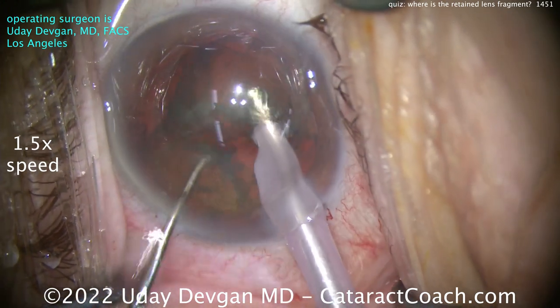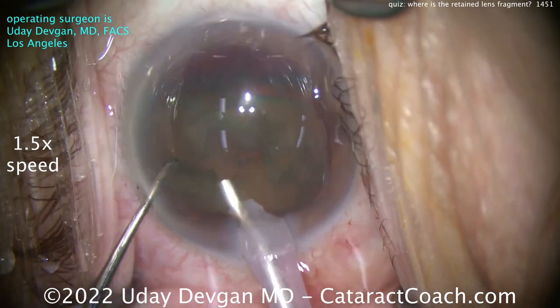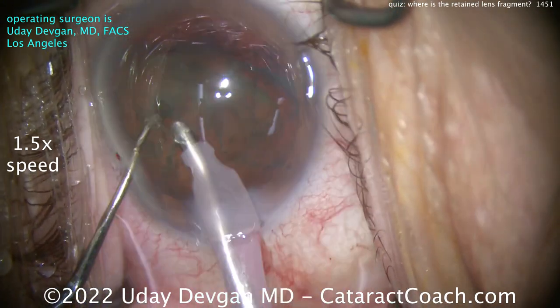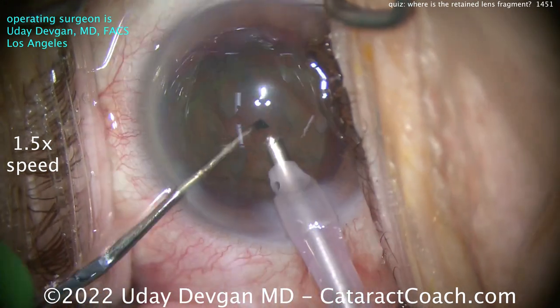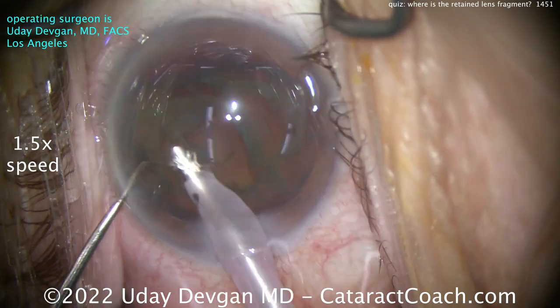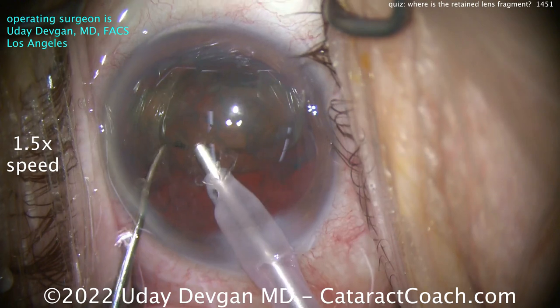Watch carefully and see where that fragment goes. That little fragment you saw in the title slide — we're going to end up with a little lens fragment coming out from somewhere, but can you figure out where it goes? Where is this piece hiding? Taking out this nucleus, it's a relatively soft nucleus.